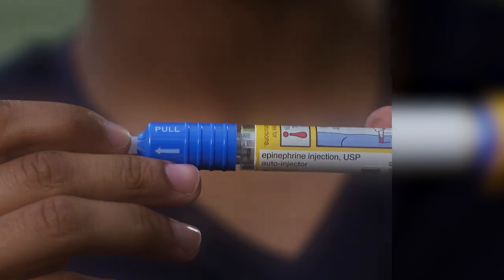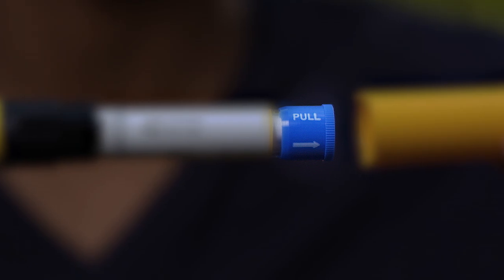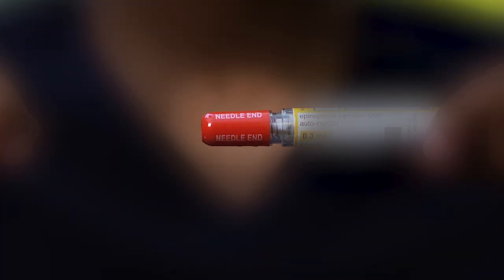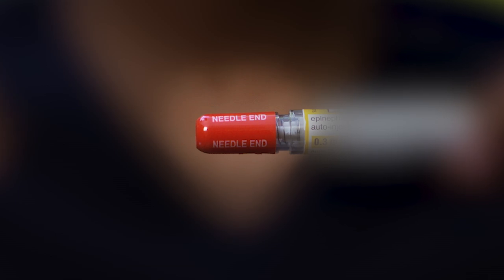Note the blue end caps. When you're ready to use the auto-injector, pull off both blue end caps. Do not remove the blue end caps until you're ready to use the auto-injector. With the blue end caps removed, you'll see a red tip. The needle comes out of that tip, so never put your thumb, fingers, or hand over it. If an accidental injection does happen, get emergency medical help right away.